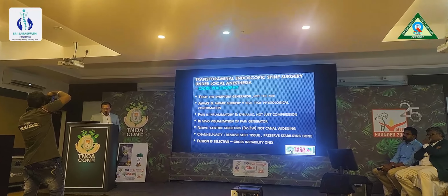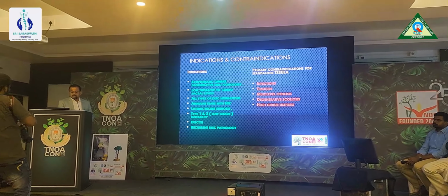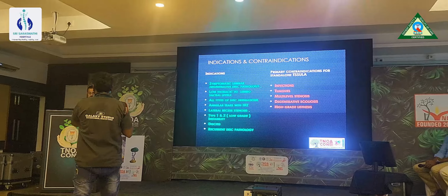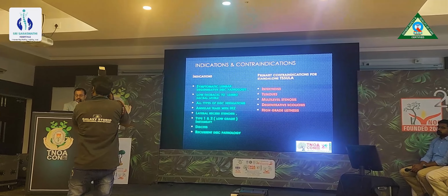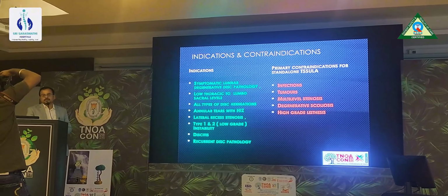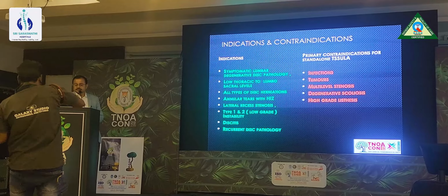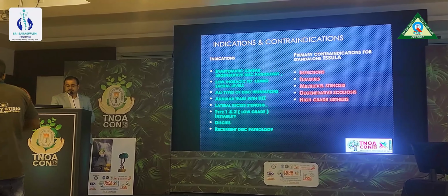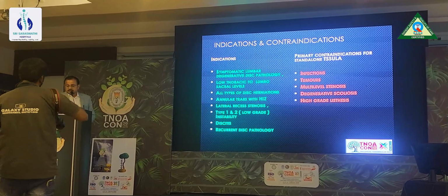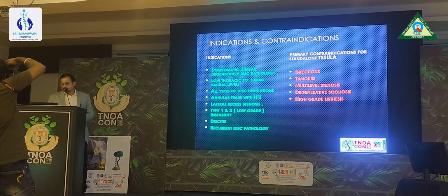and thus we do complete decompression of the neural compression. So broad indications are there, and most symptomatic lumbar disc herniations you can address, right from the low thoracic to the last mobile segments. And not only degeneration, you can also address discitis as well as recurrent pathologies. And at least for beginners, you should not touch multi-level stenosis.